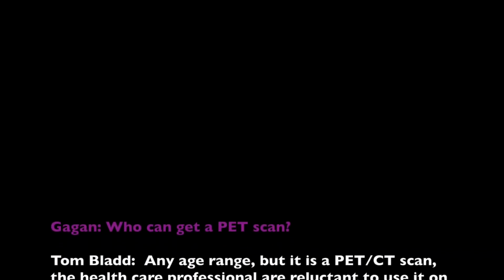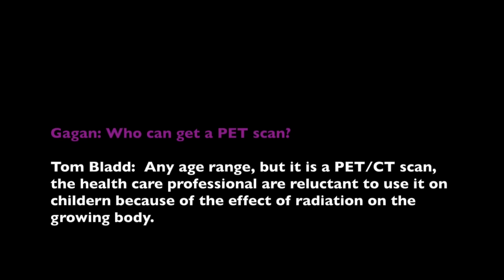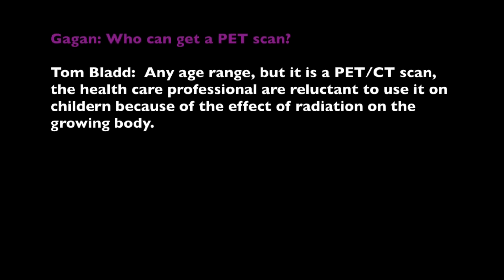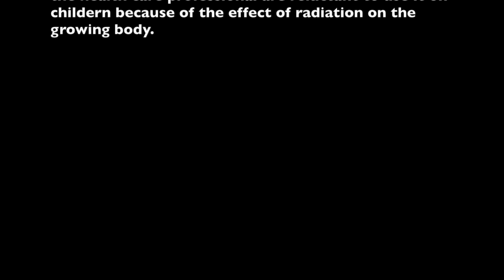It can be used for any age range. But if it's a PET-CT scan, healthcare professionals are reluctant to use it on children. It is not recommended for use in children because of the effect of the radiation on the growing body.